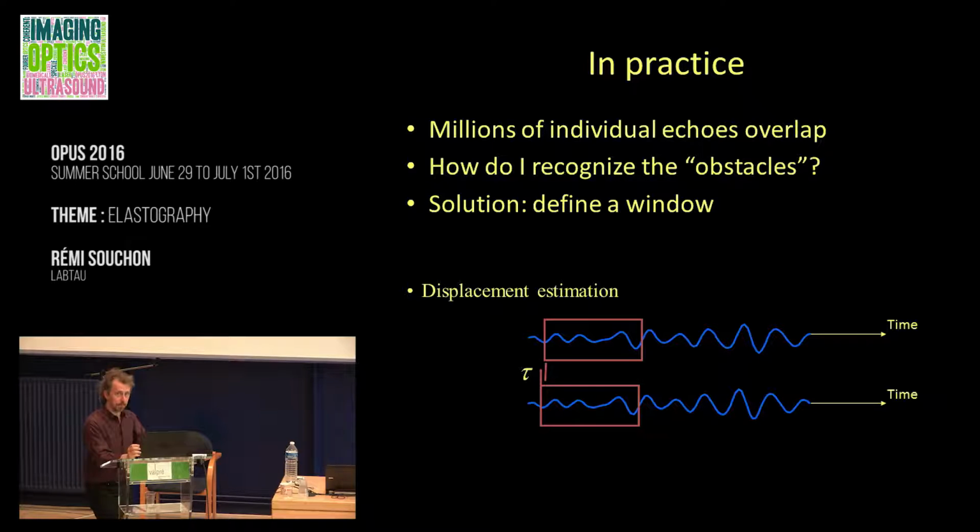And actually you can think of medical or biomedical imaging, especially medical organs, as being millions of small echoes, like from the cells, from all structures down to very small sizes. So we get millions of these small echoes within one resolution cell.